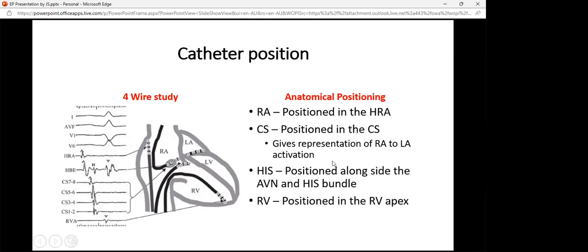So yeah, if I'm pacing the ventricle and our CS distal is leading, like we're seeing in our example here, that means that the atrium is getting activated first, somewhere around here, which is suggestive that it's probably a pathway causing that. Because if it was proximal, then we know the AV node is over here somewhere, but we're a long way away from the AV node. So we're thinking that this is probably now a left lateral pathway that we're going to be dealing with.